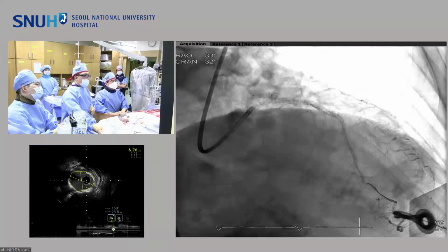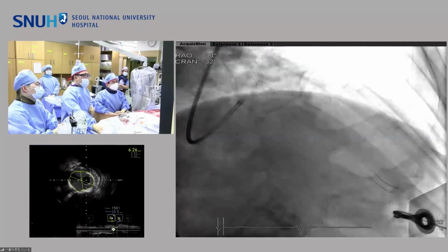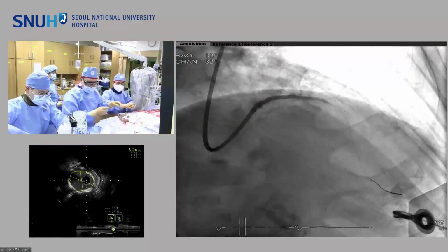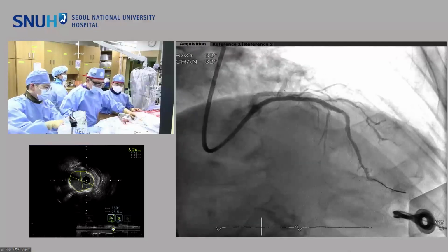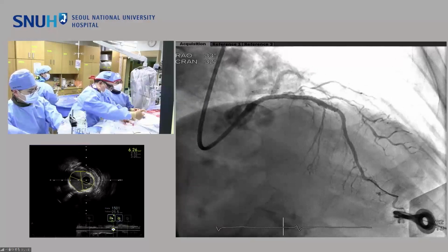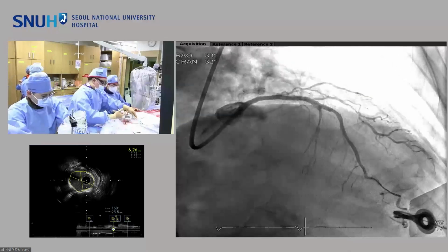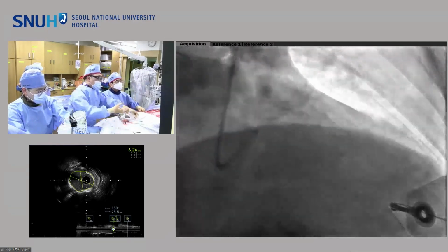And this is the image just before IVUS. And after IVUS, NG 주고 해볼까요? I will show you the image after IVUS and NG administration. Yeah, heparin coating is really required for this patient. 300. And you said in the other room that that lasts for about 30 hours?